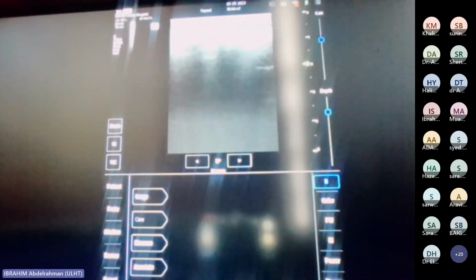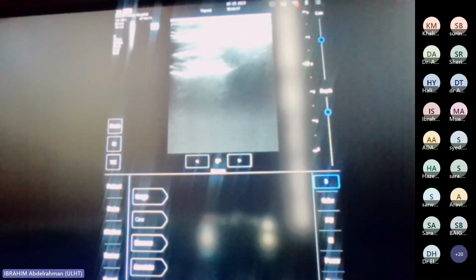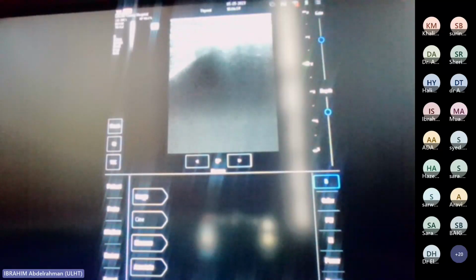That's when it is useful to turn the probe into the longitudinal section, just because you can see a little bit more of it, and it drives past the masseter there. Nice. The good thing about ultrasound is that, just like a CT scan or an MRI scan, you can find a little roadmap and work your way around.